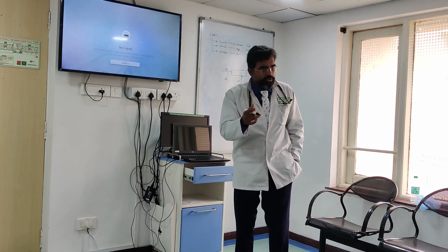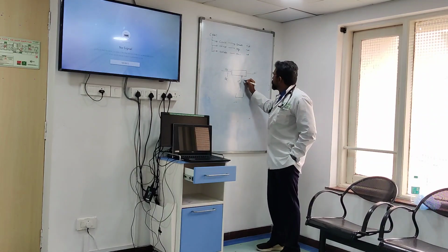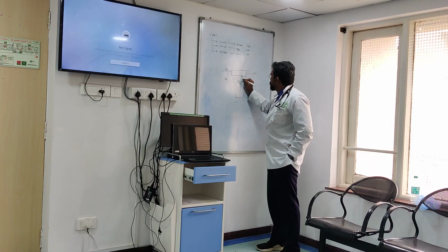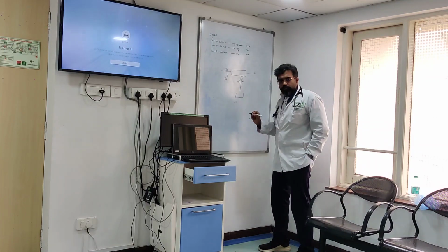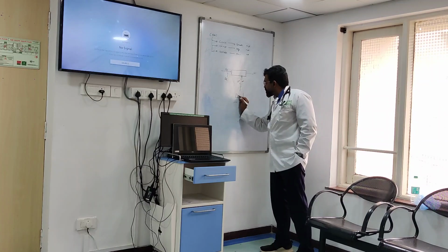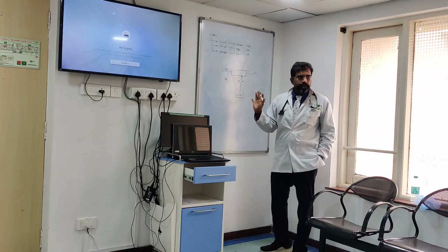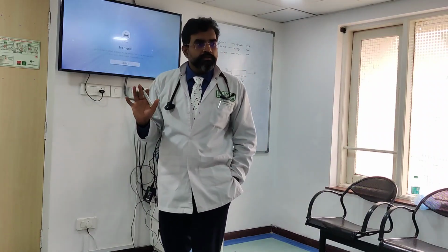And as I told you, any of these modalities, you can actually add a UF, which is like the urine. I can add a UF here. Okay. So at the end of the day, what is my effluent here? The replacement fluid plus UF, that's my effluent. Clear on this?